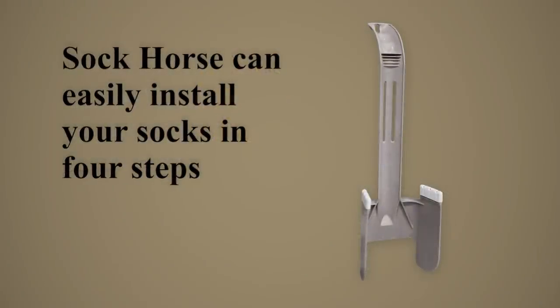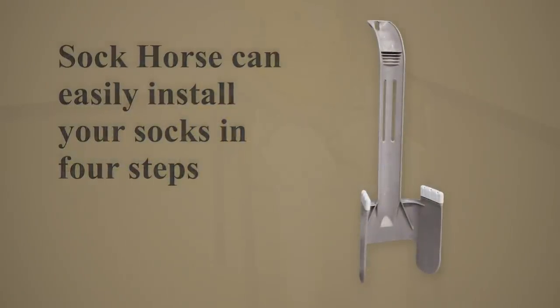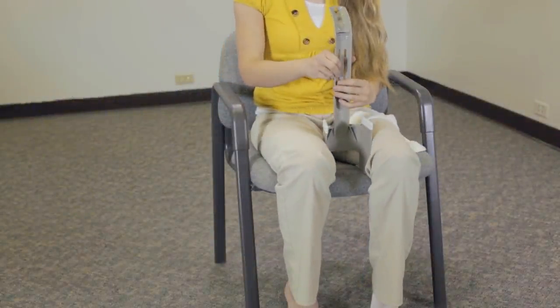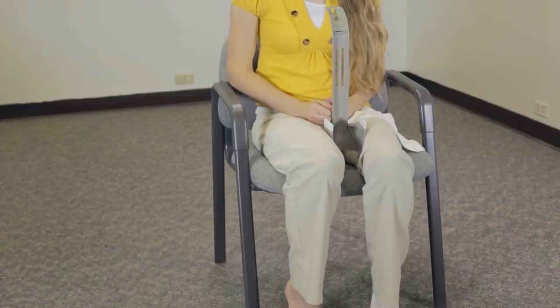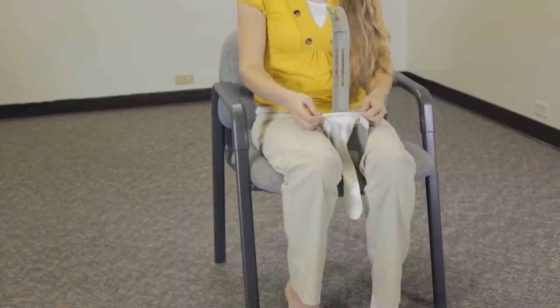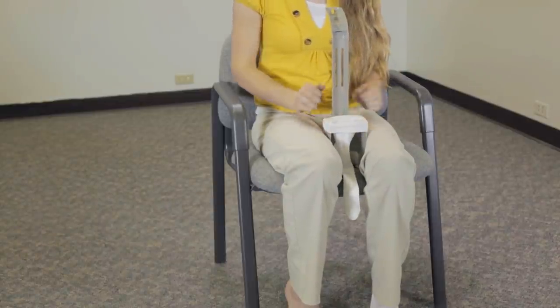The Sock Horse can easily install your socks in four steps. Step 1: Place the sock tool between your legs with the handle pointing toward your chest. Step 2: Squeeze the Sock Horse with your legs to bring the rubber grips closer together. Step 3: Stretch open the top of the sock with the toe pointing away and pull it down onto the rubber grips.